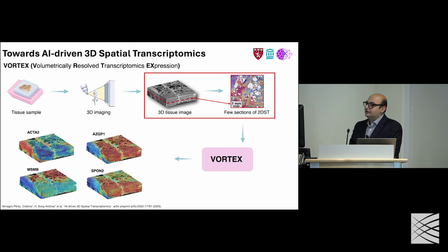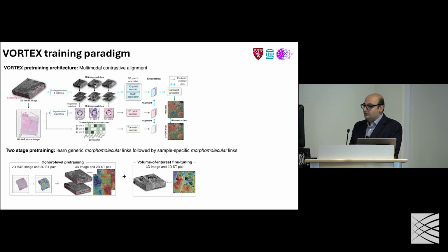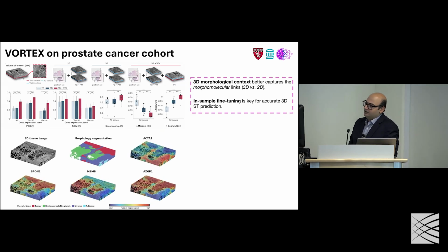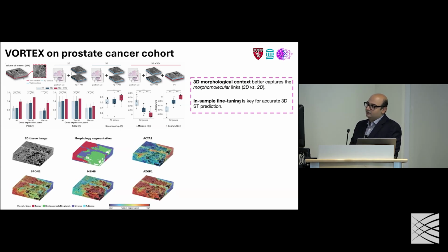Of course, we tried to do a proof of concept of this, and it works to a degree, but we are trying to validate this further. We used every architectural combination that we could, including using multiple sections and all kinds of different architectures on the machine learning side, as well as all kinds of different validation, both on the pre-training end and on the post in-patient fine-tuning end, to see if we can improve predictability, as well as validation by doing lots of multiple sections and spatial transcriptomics on it.